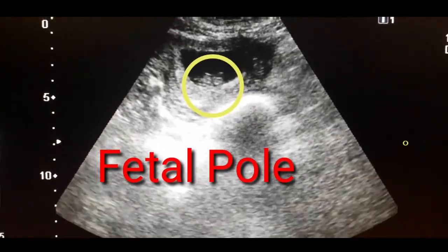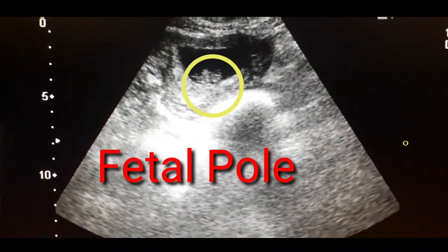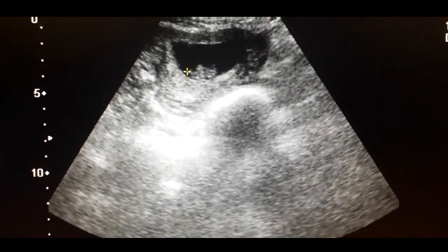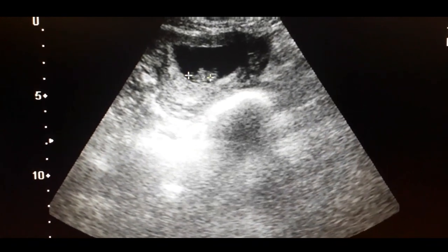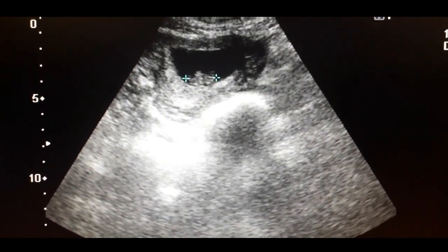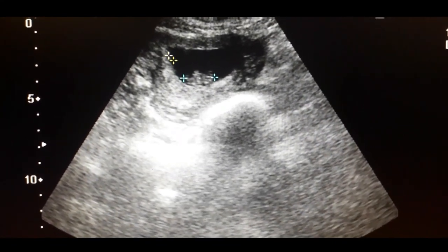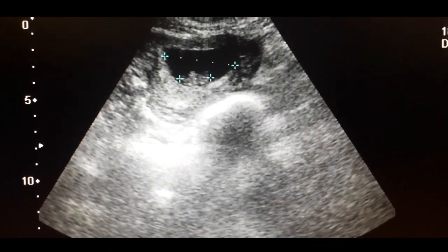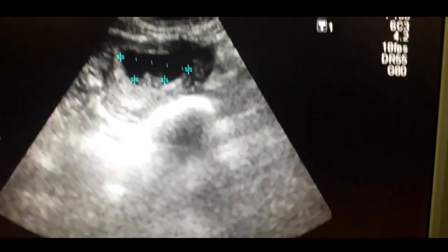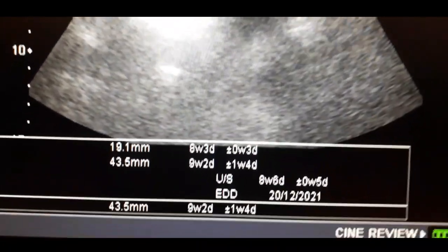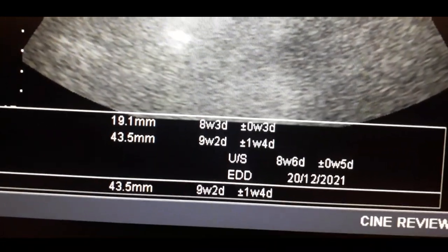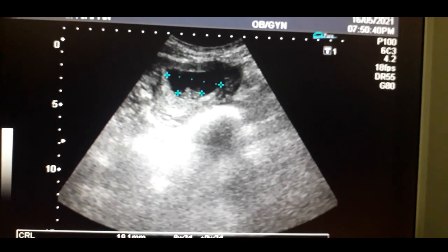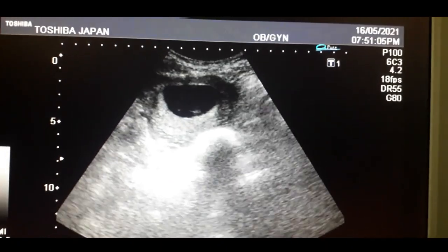I am going to measure the fetal pole and then the gestational sac. The age of the fetus is about seven to eight weeks, which corresponds to the age of the gestational sac.